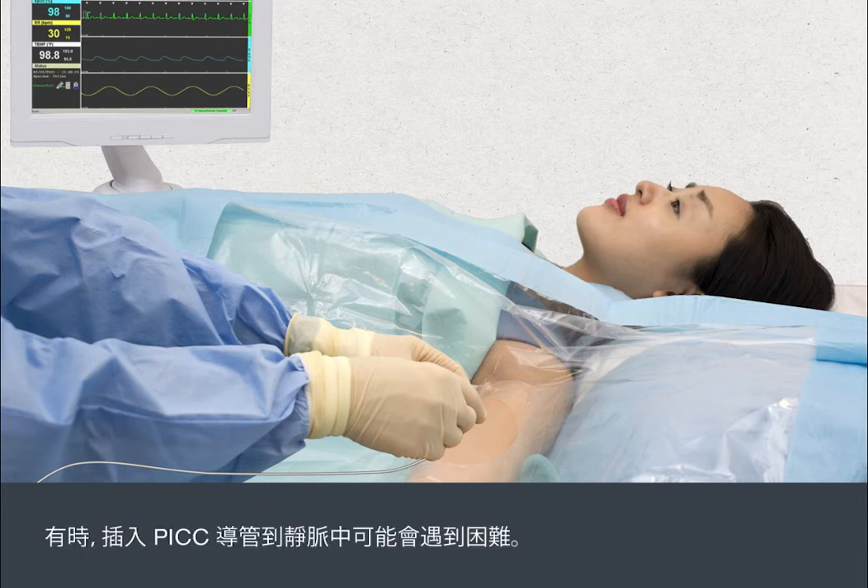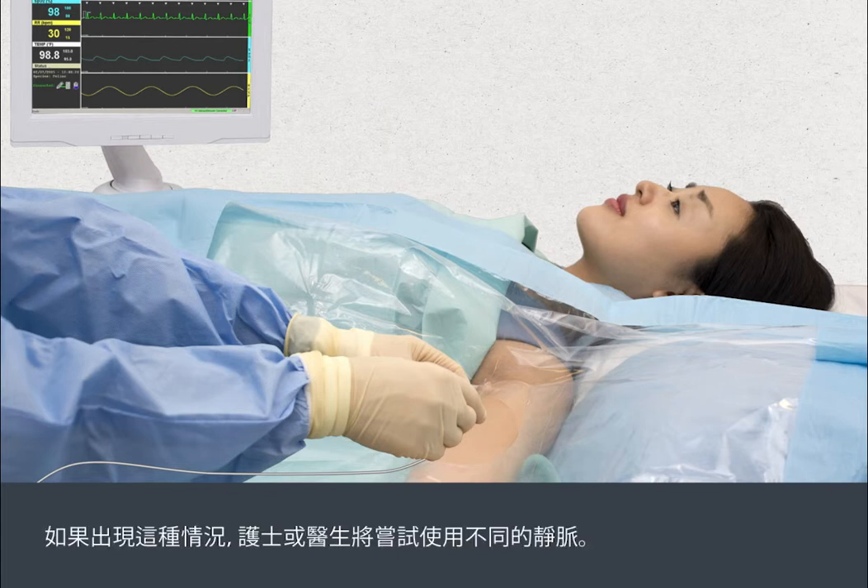Sometimes it can be difficult to thread the PIC line through the vein. If this happens, the nurse or doctor will try again using a different vein.